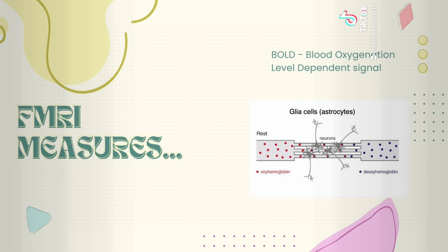Red blood cells contain a high concentration of hemoglobin. The fMRI signal depends on the hemoglobin molecule's transportation of oxygen. If the hemoglobin molecule doesn't transport oxygen, it acts as a small magnet and interrupts the local magnetic field, resulting in a decreased signal received by the fMRI machine. Conversely, when the hemoglobin molecule does contain oxygen, it instantly turns transparent in the magnetic field. This change can be observed by the machine as a small but measurable increase in the resonance signal. As such, fMRI reveals what part of the brain is active during specific functions.